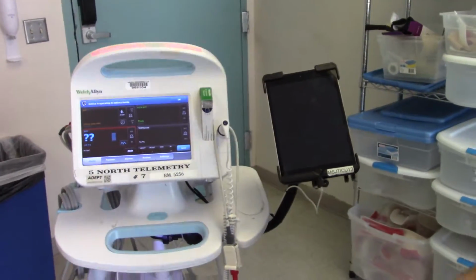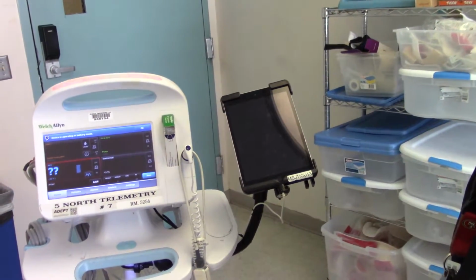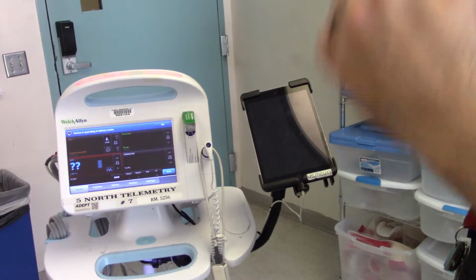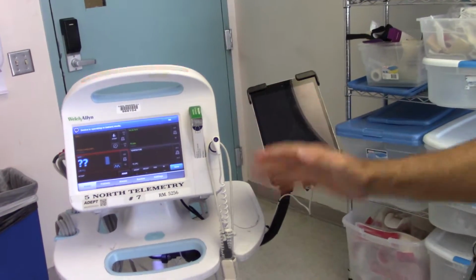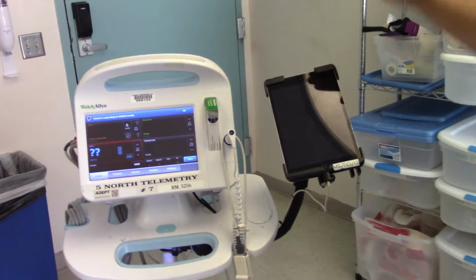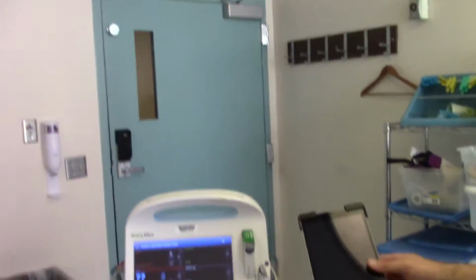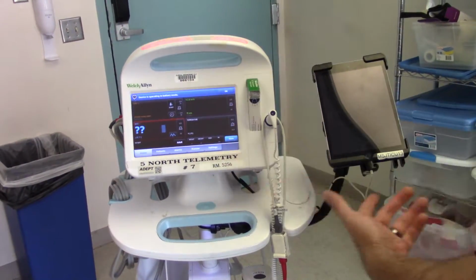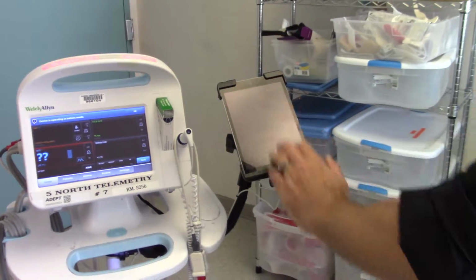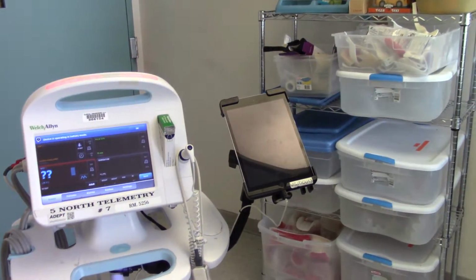I see. Okay, that's great to know. But yeah, you get it up at about that angle, and that's about where most of the nurses have it. And you have to remember most nurses are typically female, and they're a little shorter, so you have to be mindful that they're not going to want it looking down on them. Right. You don't want to have to look up at it either, but this side seems to be working pretty well, pretty comfortable. When I come back and realign it, I usually try to keep it lined up with the Welch Allyn screen, because I figure that's a consistent workspace.